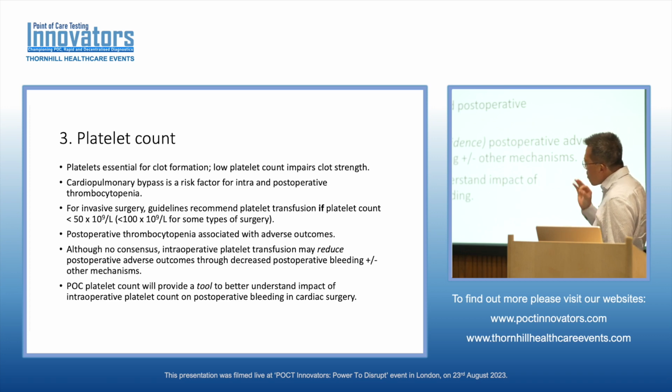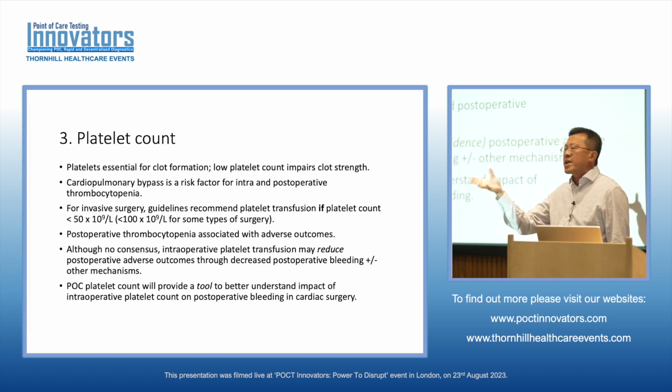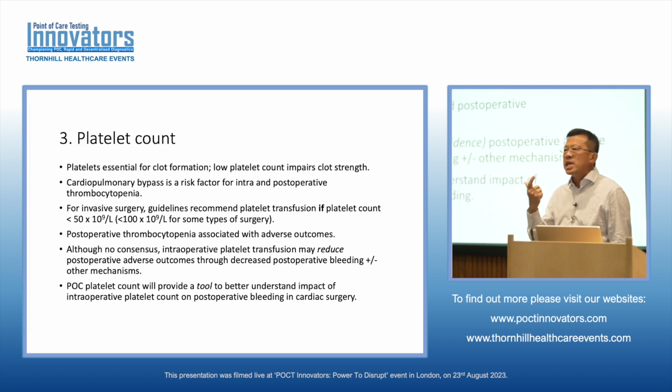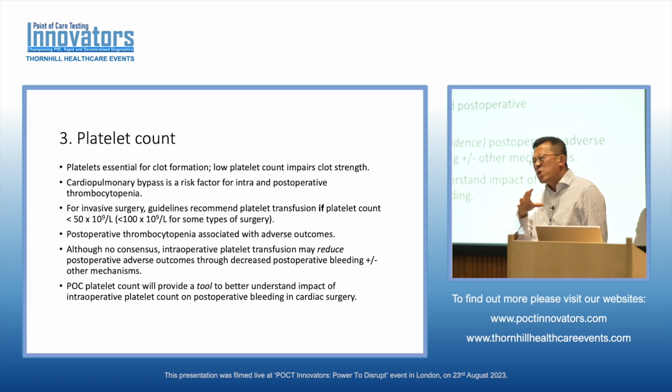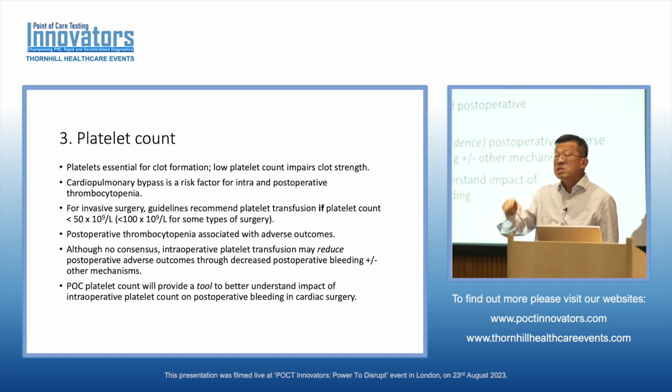So one of the things that I thought might be useful is, again, platelet count, a bit like creatinine. It's something you ask for when you have a full blood count, and you won't necessarily ask for a full blood count 4 times a day. So maybe if we had a point of care test of platelet count in some areas, such as cardiac surgery, we would have some kind of tool to investigate whether transfusion of platelets is useful or not. Because if your patient was bleeding and oozing for many hours, that's not good for the patient. But if you give a platelet transfusion and stop that bleeding, maybe that is ultimately more beneficial for the patients than the potential risk of platelet transfusion.